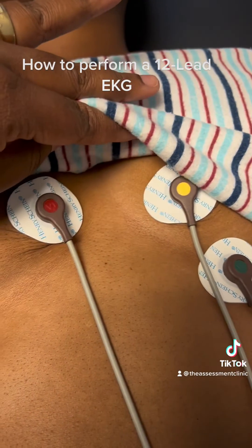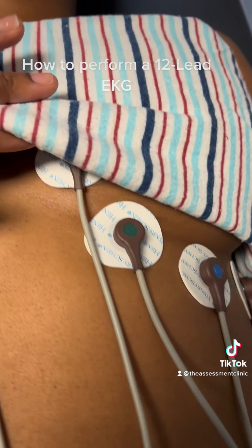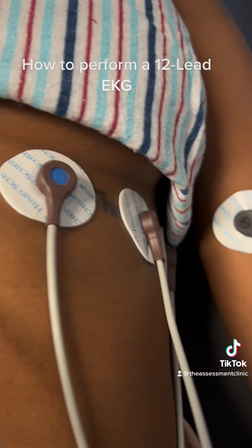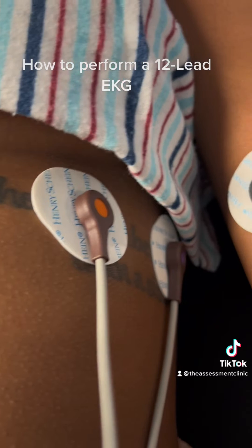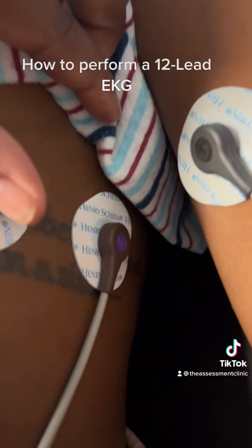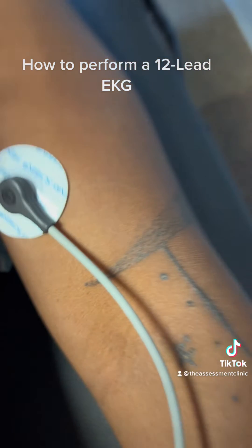I then place lead V4 mid-clavicular, even with the nipple. Lead V6 mid-axillary, even with the underarm. Then place lead V5 between V6 and V4, and lead V3 midway between V2 and V4.